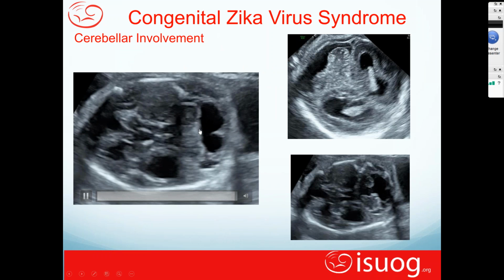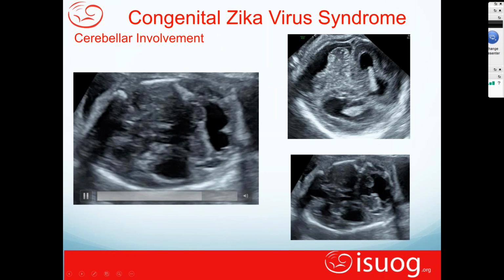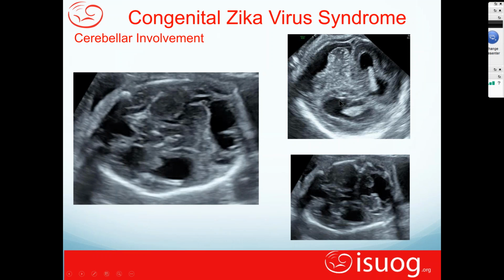The vermis seems to be present in this case, but they have a megacisterna magna. You've got to make sure you can distinguish that, but there may be other consequences of the findings. And again, on the right, the same types of changes that are seen posteriorly.